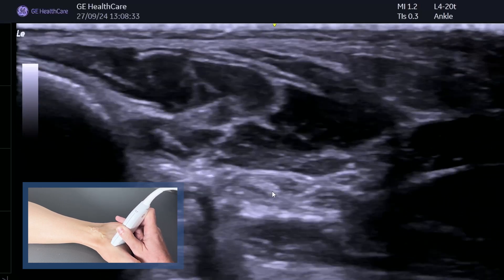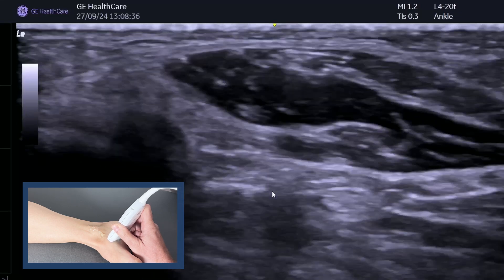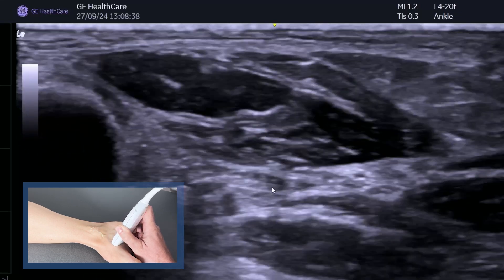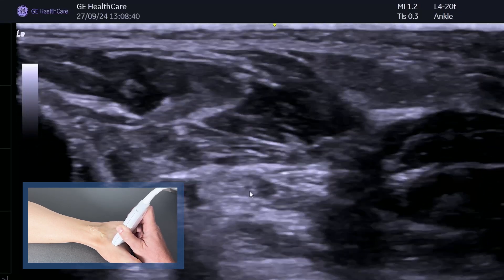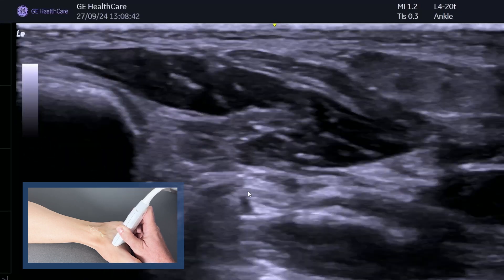As I just move transverse from proximal to distal, you can see FDL just moves over the top of FHL. So you can see it really nicely.